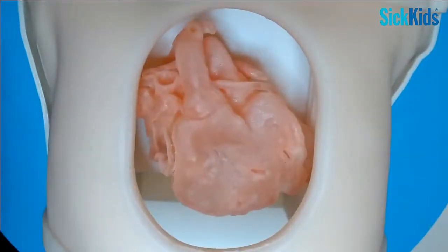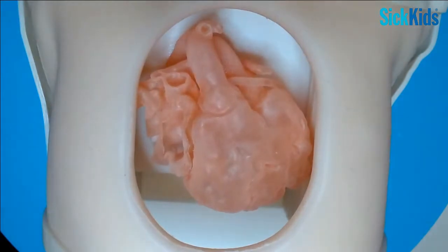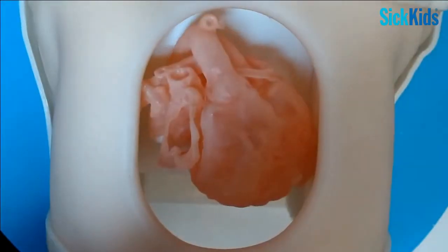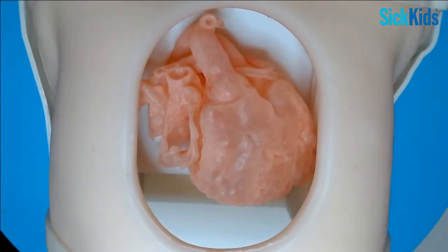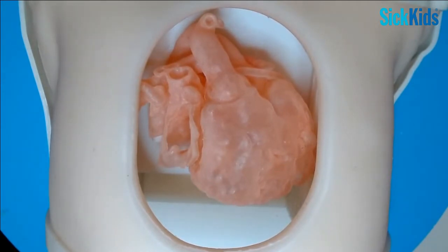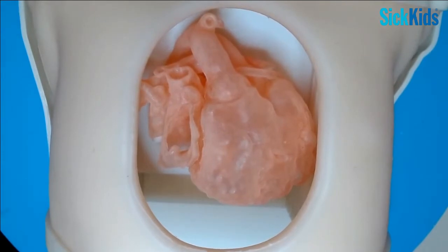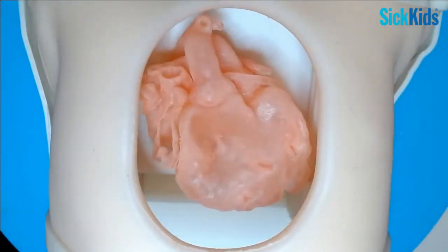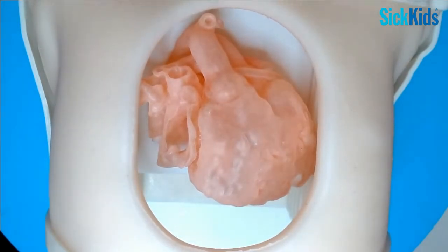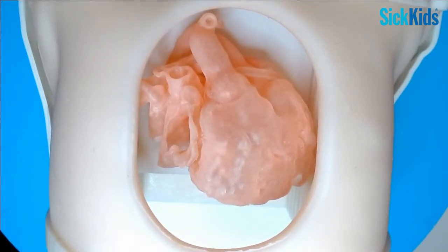There's a hypoplastic aortic arch - it's a very common association. What you worry about is that often the actual aorta is a little bit small, and so what will become the pulmonary artery might be a little bit small too. The VSD is usually described as sub-pulmonary. The nature of the DORV is that the pulmonary artery is closest to the ventricular septum, so you have to work out the best way of committing the VSD through to the great vessels - usually it means an arterial switch to bring the aorta closest to the VSD. The VSD itself is usually perimembranous, but it can be muscular outlet.